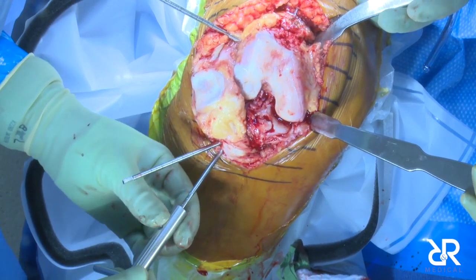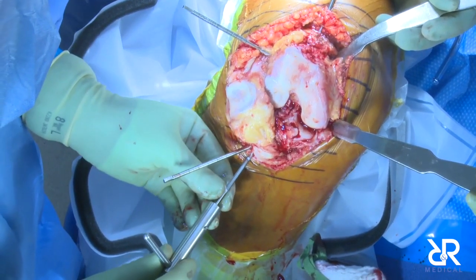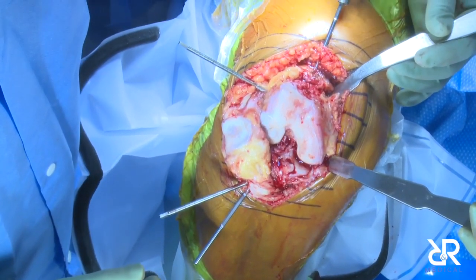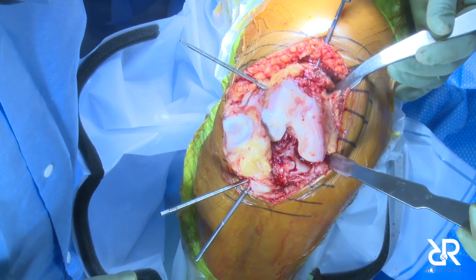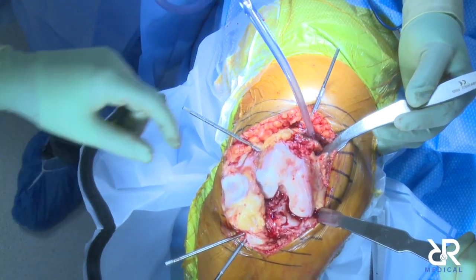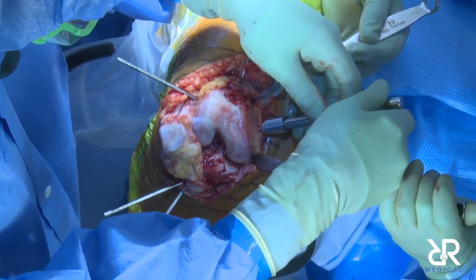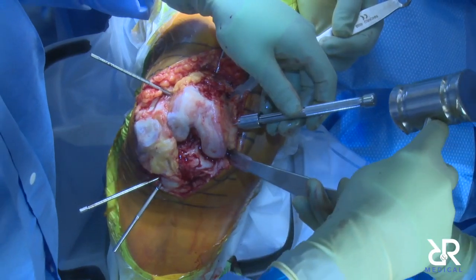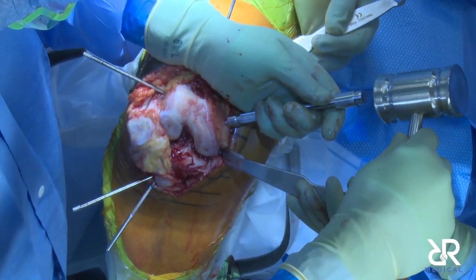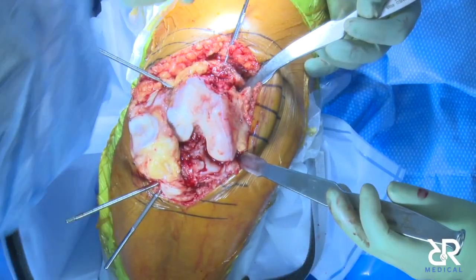So the key is to have the slider towards you, so you can turn it so that you can access it. And then same here with the slider. Access it here, and then the pegs need to be far enough away from the slider, because those are your recovery markers, right? So if you lose registration, and I kind of countersink these because you don't want them to move, because then you really lose things.